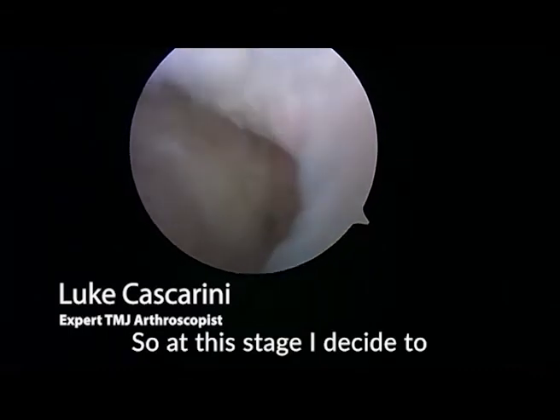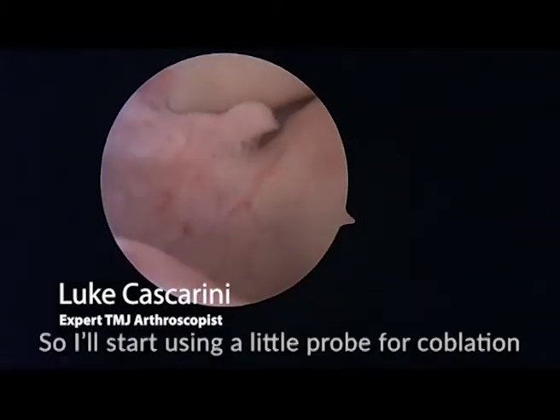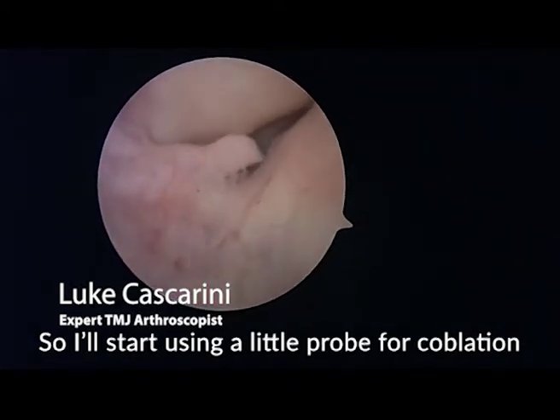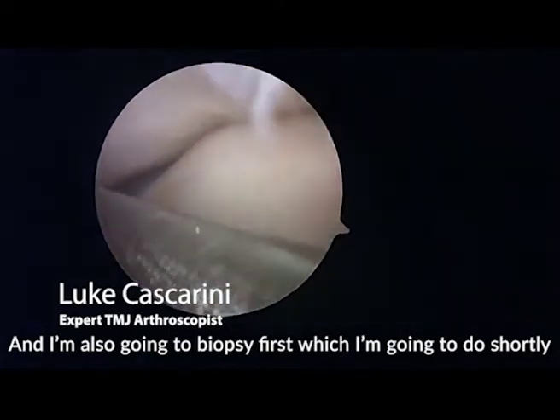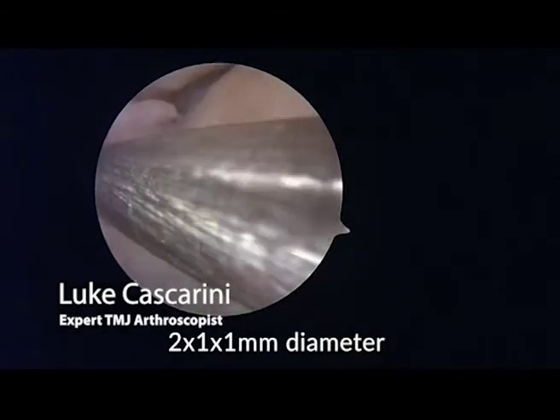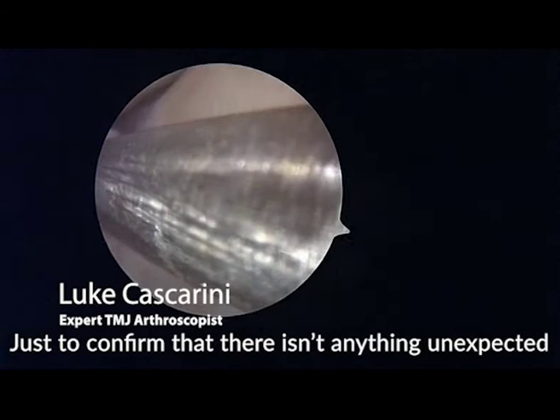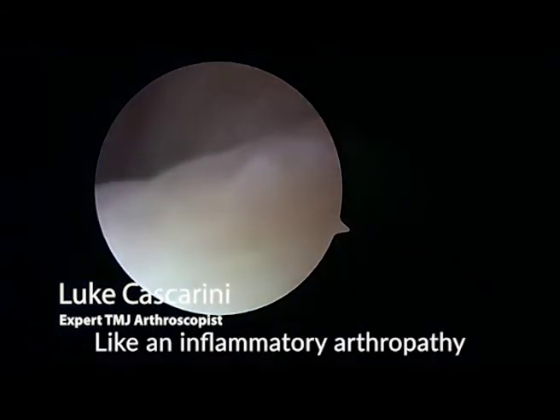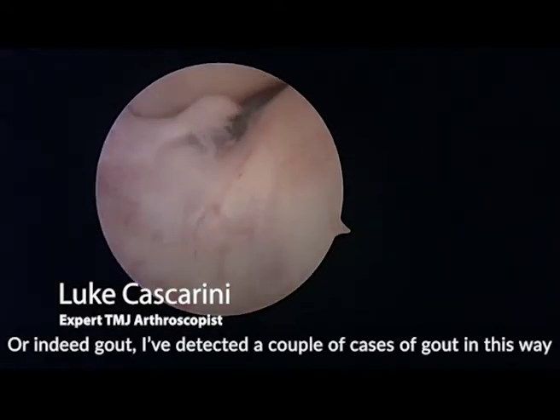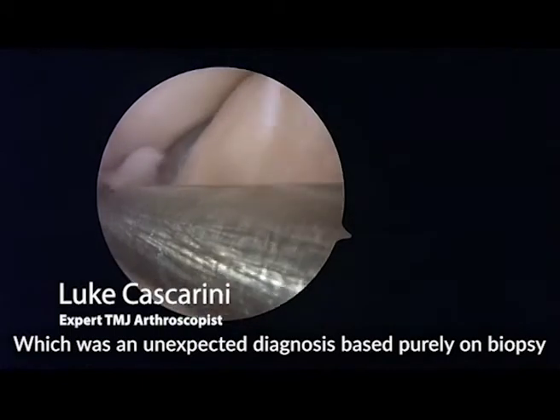At this stage I decide to use some coblation and some platelet-rich plasma. I'll start with a biopsy, which I'm going to do shortly with a little grasper. That gets a small amount of tissue — about two by one by one millimeter — which is sent to the histopathologist just to confirm there isn't anything unexpected like an inflammatory arthropathy or indeed gout. I've detected a couple of cases of gout in this way, which is an unexpected diagnosis based purely on biopsy.